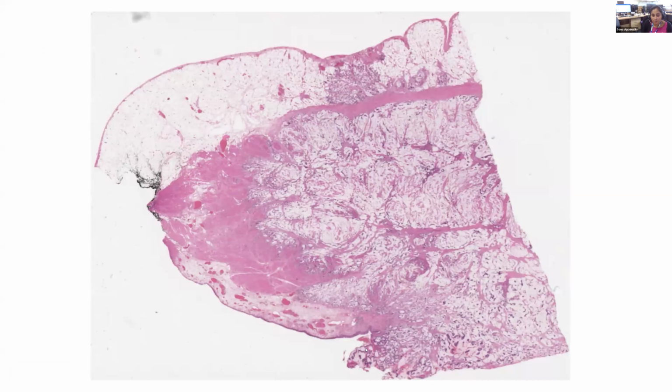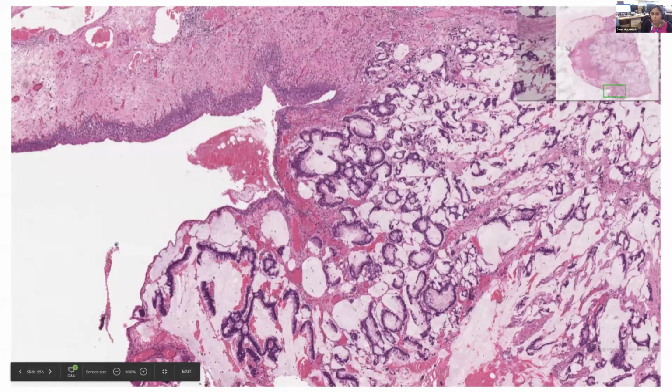We have a lesion coming from under the epithelium all the way reaching up to the serosal surface. So there is a sharp demarcation. And by eye of faith, we'll say it's probably predominantly centered in the muscle. That's probably the inked margin, so the margin for the partial cystectomy excision. Away from that margin, we'll go a bit closer. It was all mucin, probably.